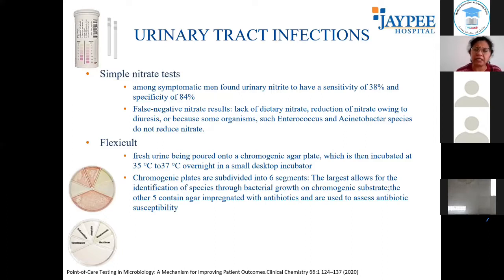So there are challenges with all POCTs, is all that I'm trying to say. We just can't blindly follow them. We still have to look at the technical expertise, and POCT cannot be left as saying that it's point of care testing and the lab does not need to see it.